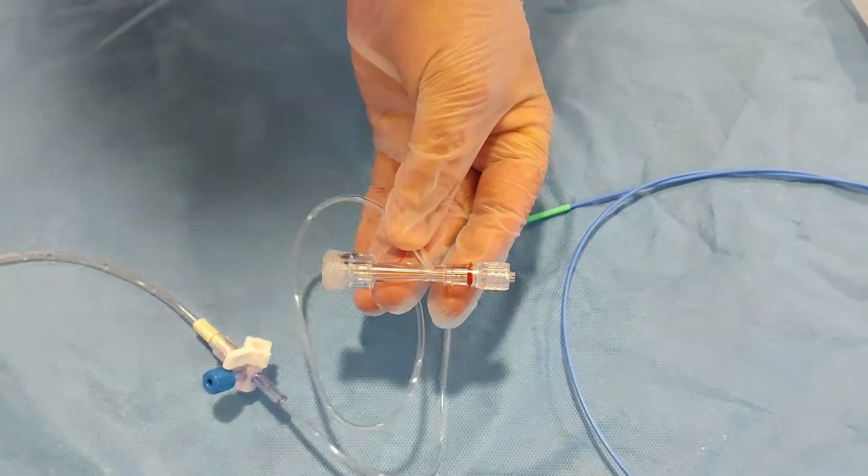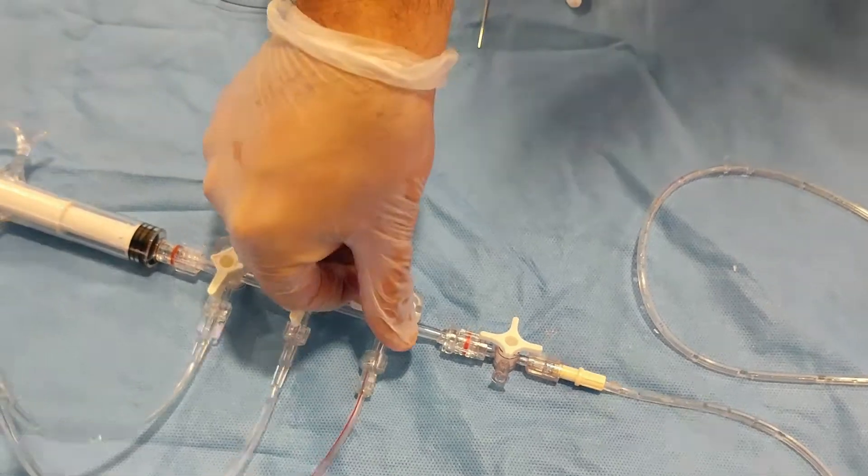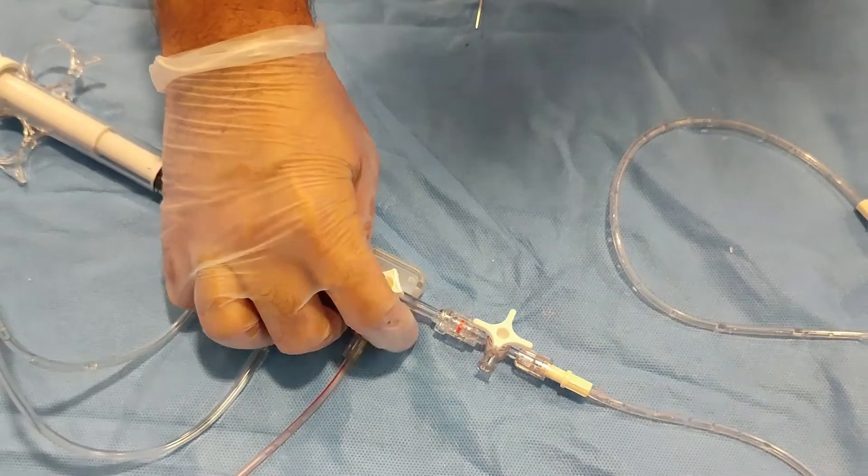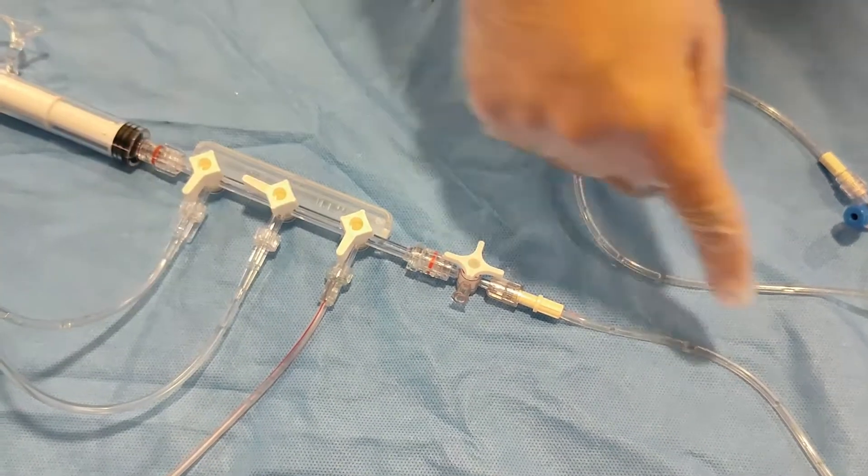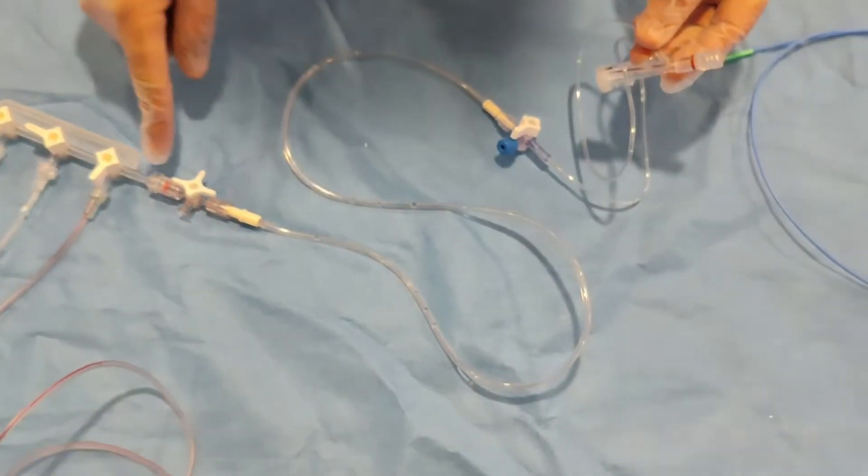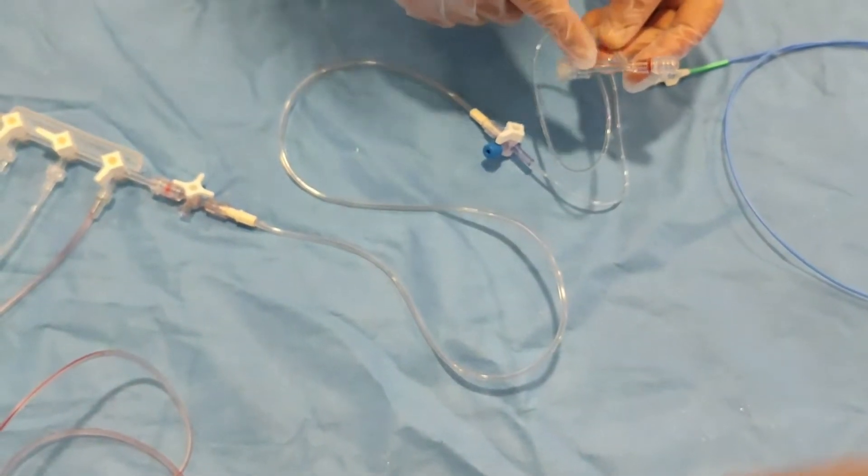Once you open it, now the question is how to make it air-free. It's very easy, come back here. As we mentioned in the last video, just turn this one off towards the pressure side. This is a pressurized saline bag. Just open it towards the patient.